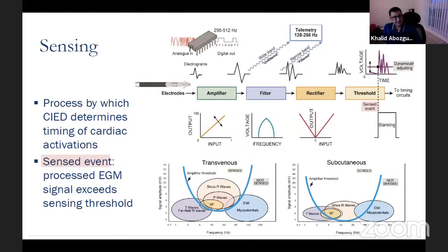And I think that's the comment. In my humble opinion, if you have a center where they're not used to or comfortable doing an MRI in someone with a pacemaker, and you have someone with CRT with 3 leads, they're unlikely to get good quality images, and unlikely to get any useful information from it. So I would be looking into another imaging modality if I was you. But can it be done? Are we doing it in our center? Yes, of course we are.